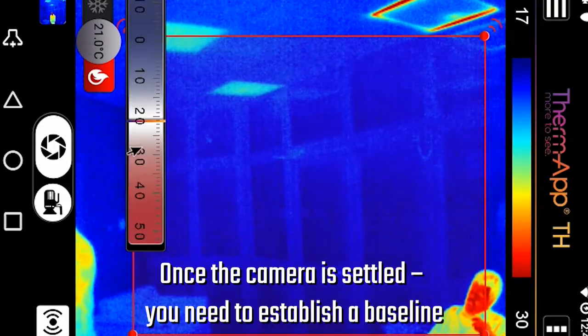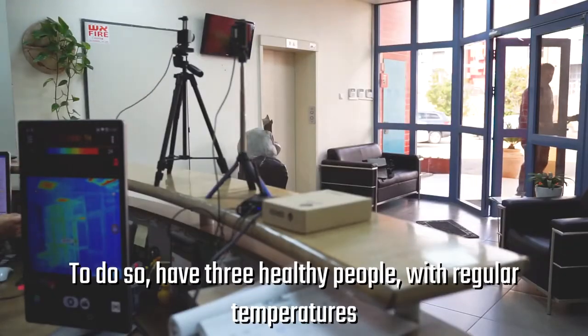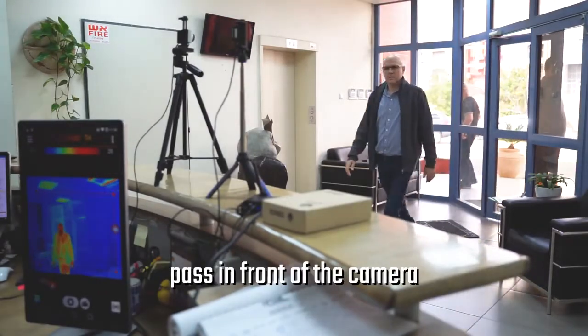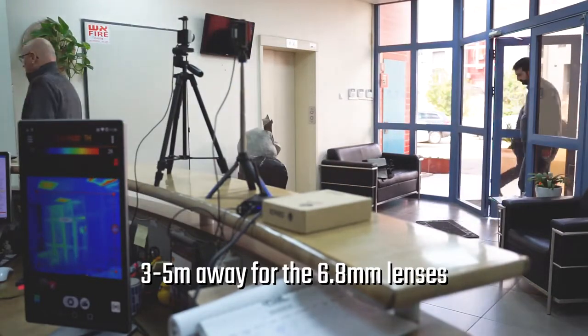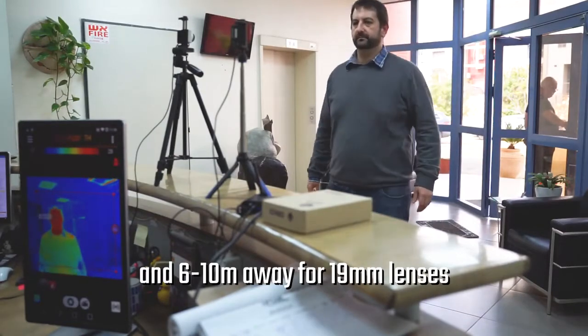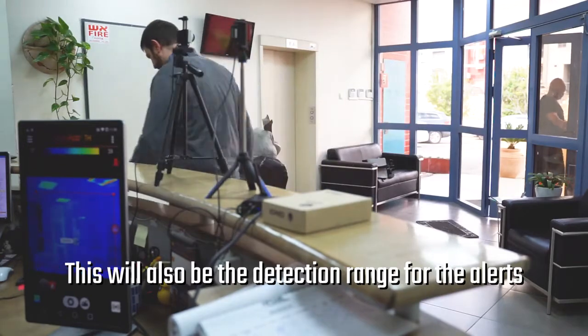Once the camera is settled, you need to establish a baseline. To do so, have 3 healthy people with regular temperatures pass in front of the camera, 3 to 5 meters away for the 6.8mm lenses and 6 to 10 meters away for 19mm lenses. This will also be the detection range for the alerts.